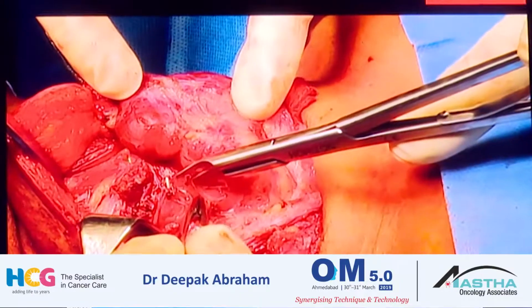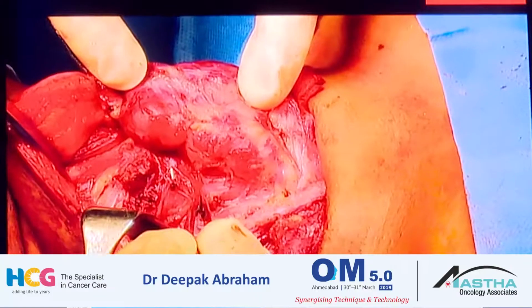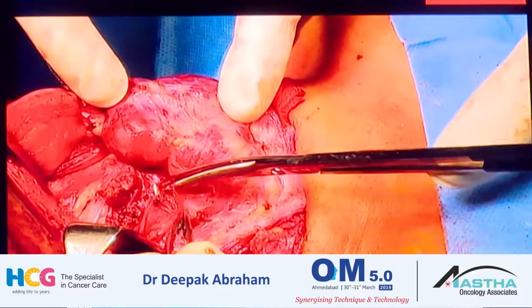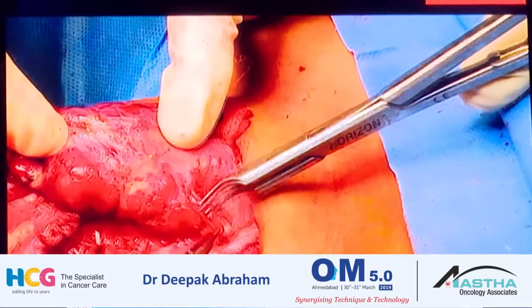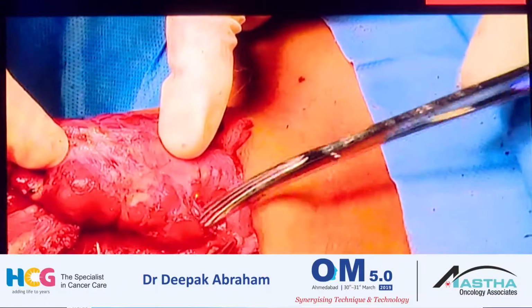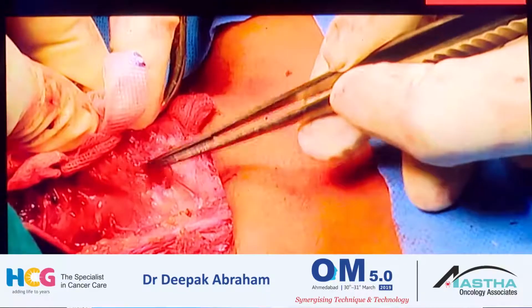And as I said, that's the tubercle, and this is the nerve which is below it. So when you rotate the tubercle, you'll see the nerve. So say, let the nerve come looking for you, don't go looking for the nerve. And so that you can see was the inferior parathyroid now coming with a clip and dropping it down off the thyroid which is sitting there. So you can see a lot of dissections happening on the para.